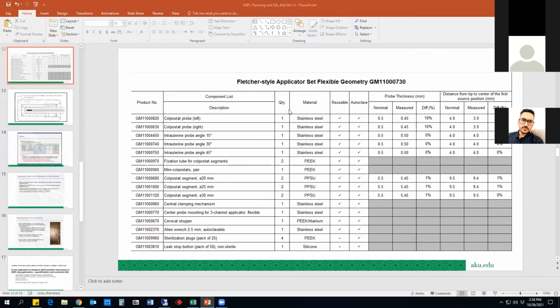Okay, we have another question from a participant. Have you measured applicator attenuations in terms of HU or electron density for verification? We have not mentioned this here, but when we do the CT, we can do this during the treatment as well. If you are not making this a part of your quarterly or annual QA, you can measure this while you're doing the planning. It is not our practice, but it is recommended to measure the HUs quarterly or annually as per the task group report.